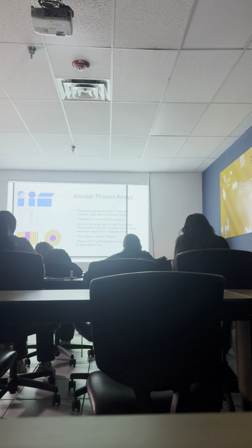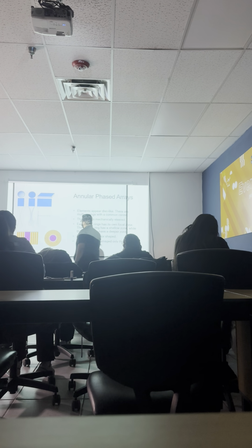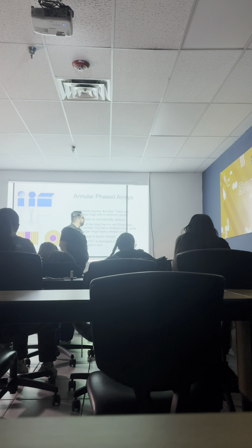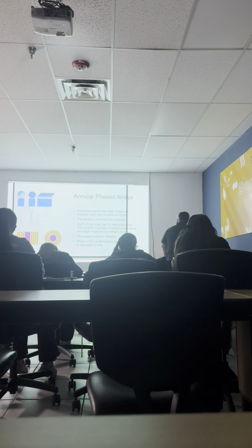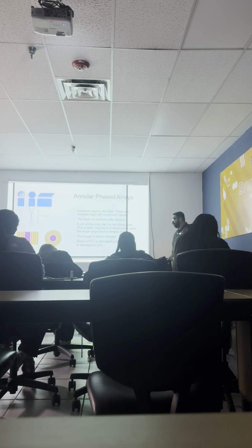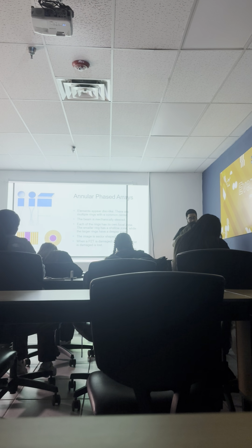And here we have our annular phased arrays. Like I mentioned before, we have one center disk, and surrounding that center disk are rings of PZT. These are actual elements. Elements appear disk-like. There are multiple rings with a common center. The beam is mechanically steered. What does it mean by mechanically steered? It's not electronic. Something physically moves the crystals.